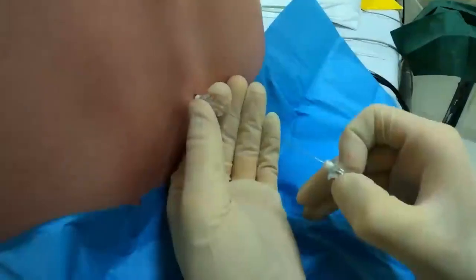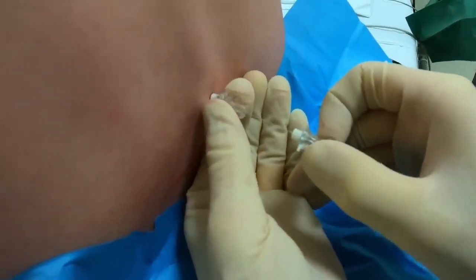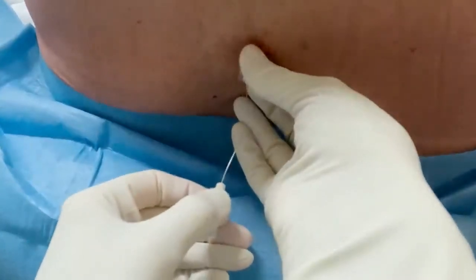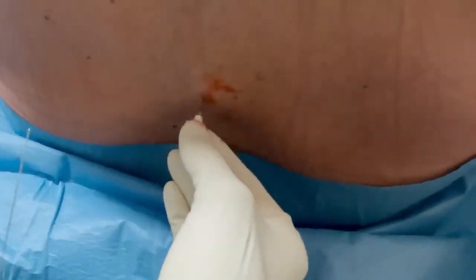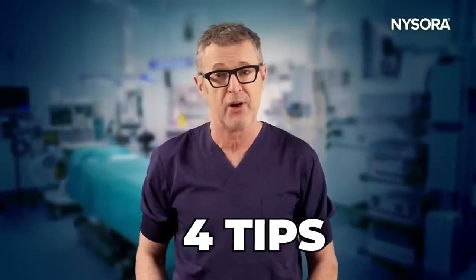Have you ever experienced or witnessed a difficult spinal puncture in a young, slim patient with landmarks visible from a mile? In these cases, no matter what you do, you always seem to hit the bone. In fact, I will dare to say that most struggles with spinal anesthesia that I have witnessed were in skinny patients with easy landmarks. In this video, you will learn 4 specific tips and techniques that will make your next spinal anesthesia or lumbar puncture much easier and more predictable.